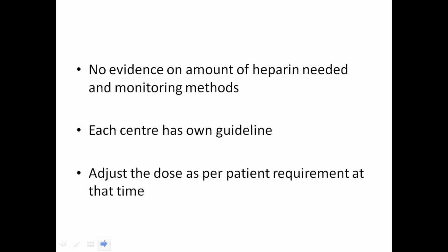Again, how much heparin do we need? There's no evidence for how much heparin you need, but whatever you need to maintain the circuit patency. And you need to take into consideration the patient's coagulation system. Is the patient bleeding, or is the patient in a hypercoagulable state, or how is the patient's coagulation system? So you need to take this into account as well. Each center has its own guidelines, and you have to adjust it. It's a dynamic thing. So you can't have one fixed heparin dose for all throughout the circuit time. Depending on the patient's coagulation system and the requirement, you adjust the doses.